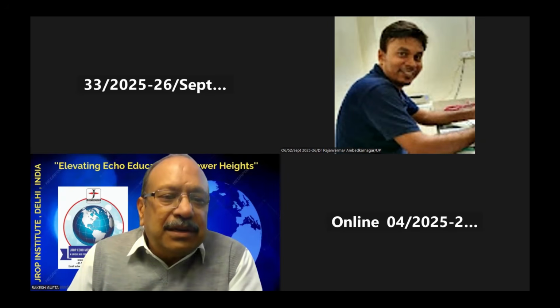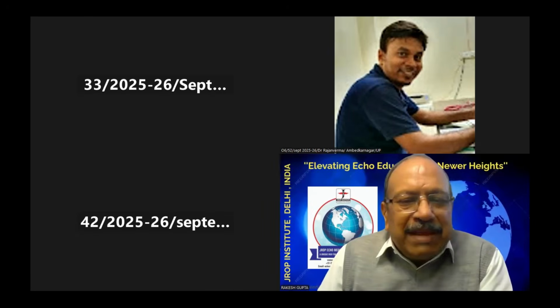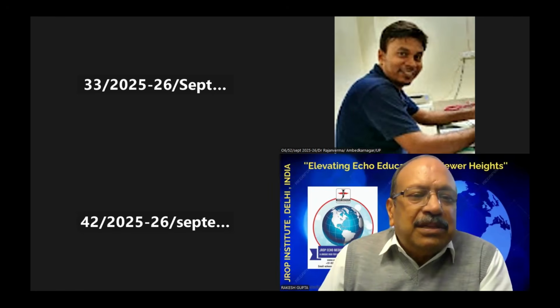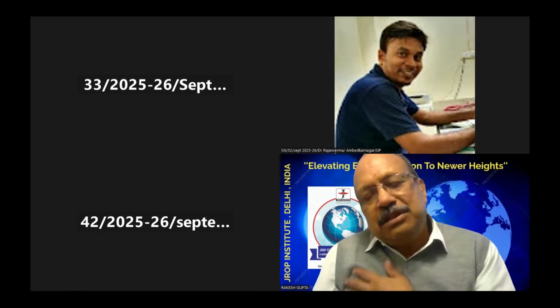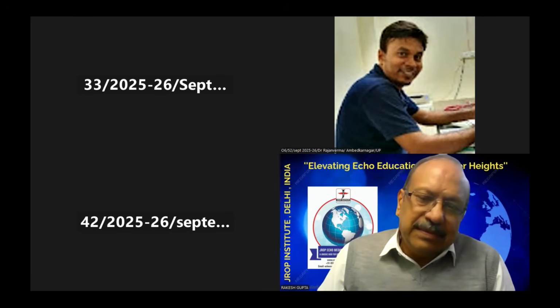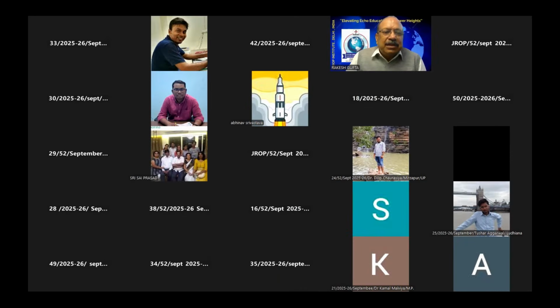I think I did load in my echo pack, because that is one variety which is, fortunately and unfortunately, very commonly seen nowadays. And we are finding more and more people presenting with this. At one time, we were looking at aortic stenosis being degenerative. Now we are looking more at people presenting with degenerative mitral regurgitation, apart from the usual stenosis. So let the echo pack get going, and meanwhile, let me start taking a question.